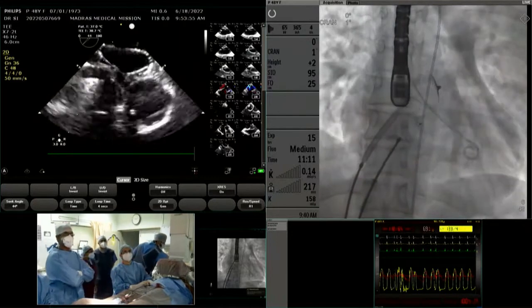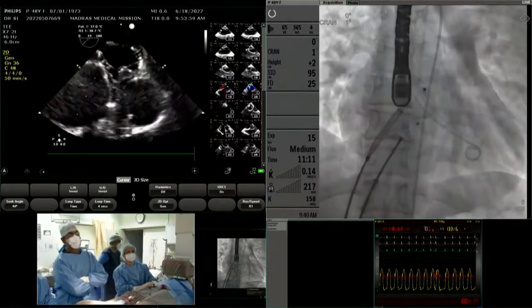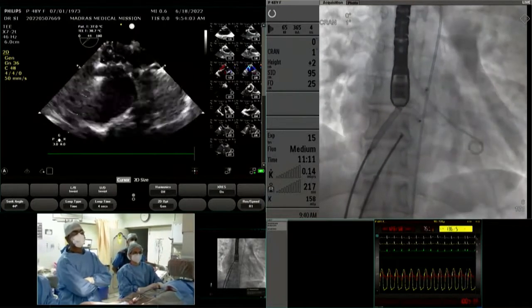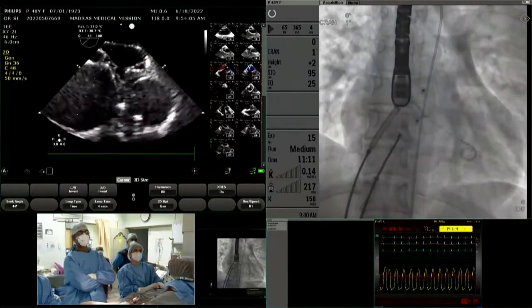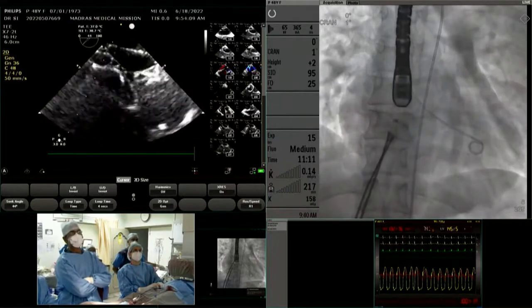No, I'll show you that. You don't tug it, you deploy the LA disc in the mid LA before the septum and rapidly deploy. The RA disc will support the LA disc. RA disc will prevent the prolapse of LA. You can show that to fluoroscopy and explain, Shiva, what you have done.